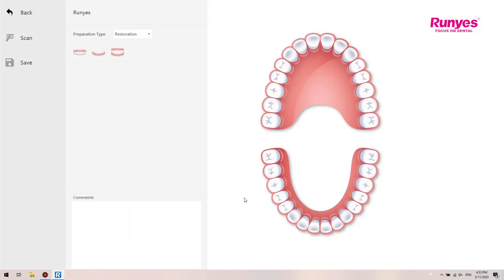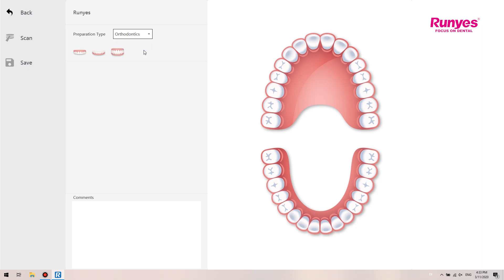After creating the case, users can choose the scanning method. The software provides three scanning methods: restoration, orthodontics, and implant. The scanning process of restoration and orthodontics is the same — upper jaw, lower jaw, and occlusion. Restoration has higher accuracy in analyzing the data of a single tooth, while orthodontics has higher accuracy in data on the dental arch.